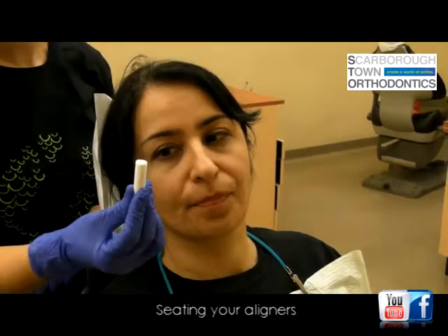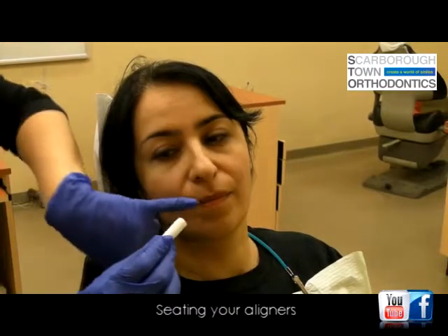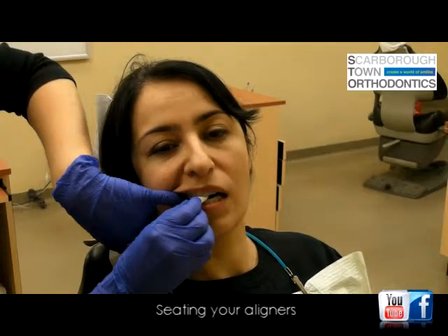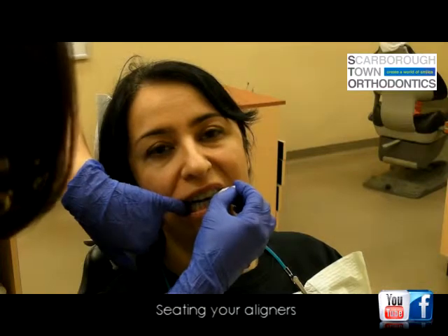And once you have them in all the way, you're going to use a tool called a chewy. A chewy looks like a piece of rubber. And you basically bite down on it from one end, and you're going to open and close just like Faye's doing. What this is going to do is help to seat the aligner all the way onto your teeth to make sure that it fits properly.